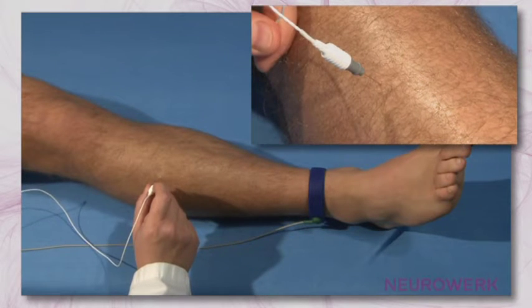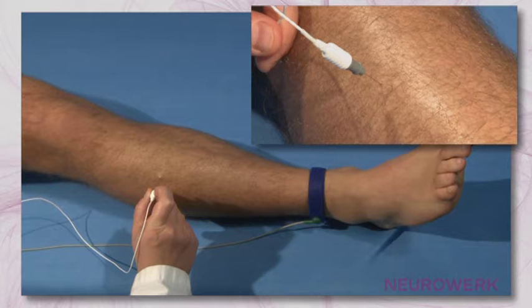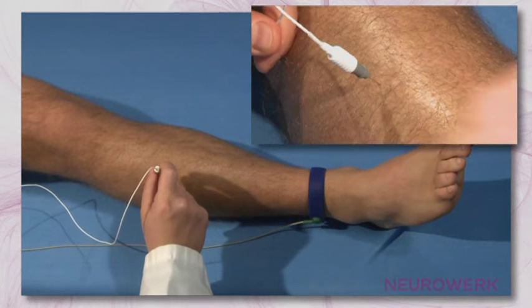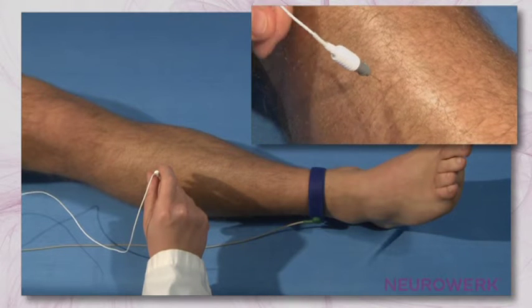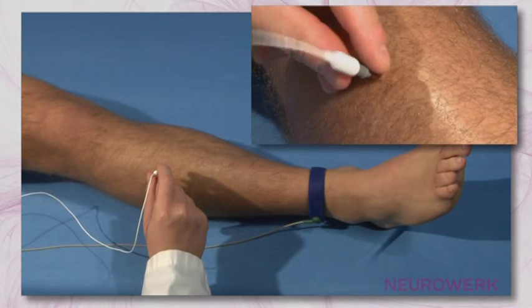Shortly after abatement of the insertion activity, various spontaneous phenomena that have been triggered by the stimulus of the needle relocation can occur. Only fasciculations can be recorded with a prolonged and unchanged needle position.